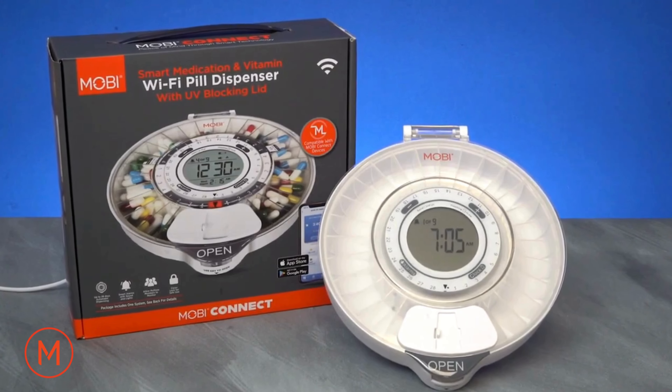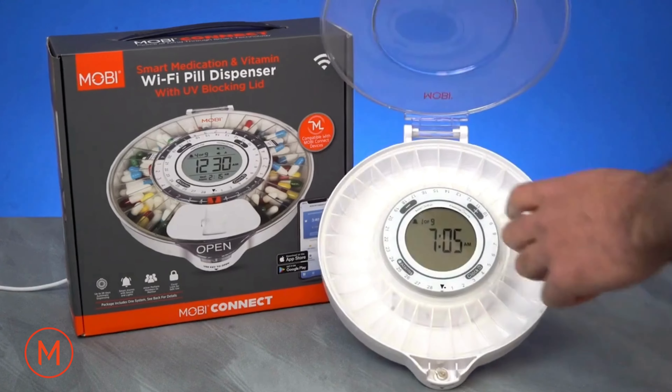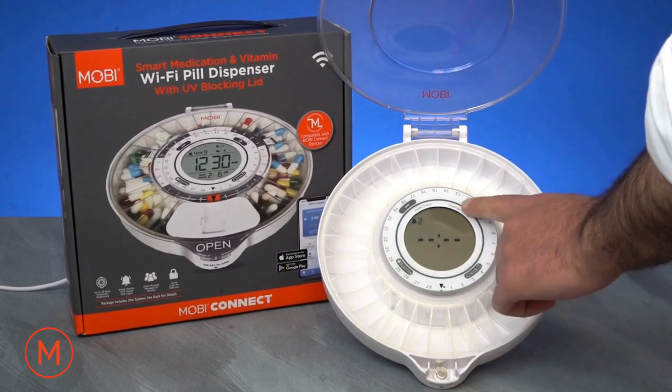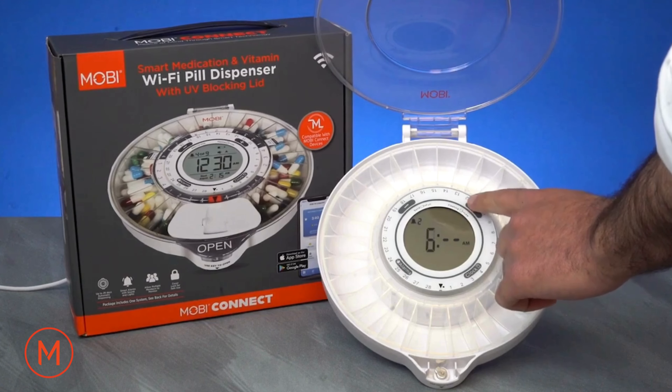To set a second alarm within a daily cycle, press the plus button to set the number of alarms per day. Press the alarm button and follow the same previous procedure, then press the alarm button again when done.